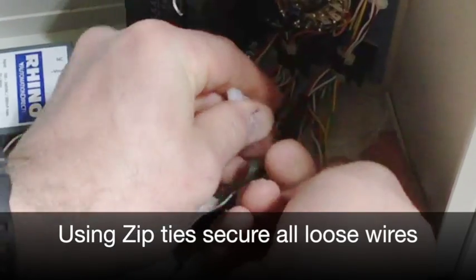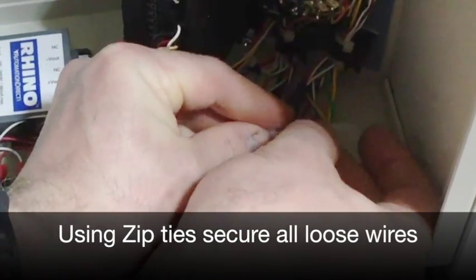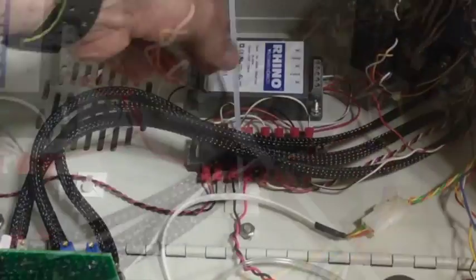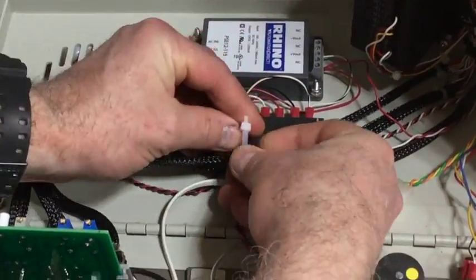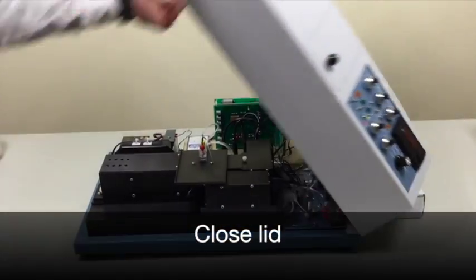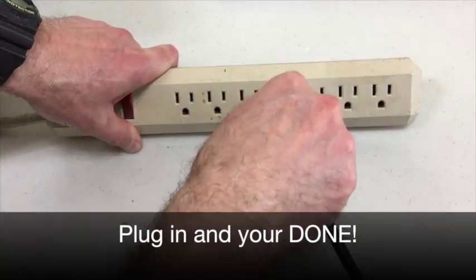Using the included zip ties, zip tie down all the remaining wires as shown in the video. Then cut off any remaining tails from the zip ties. Close the lid, plug the instrument back in, and you're done.